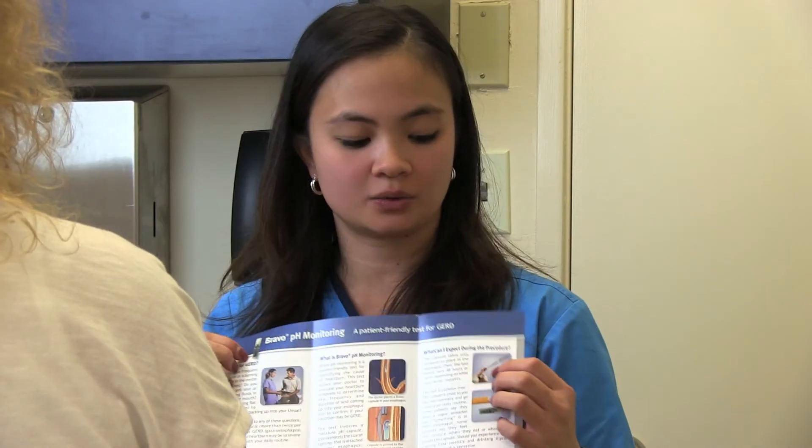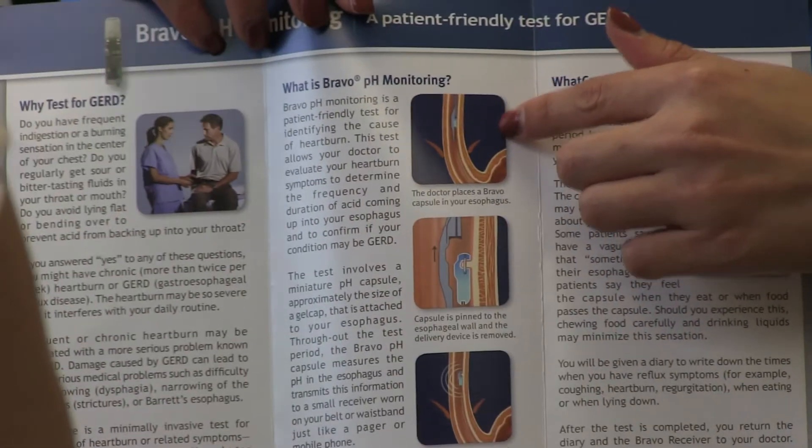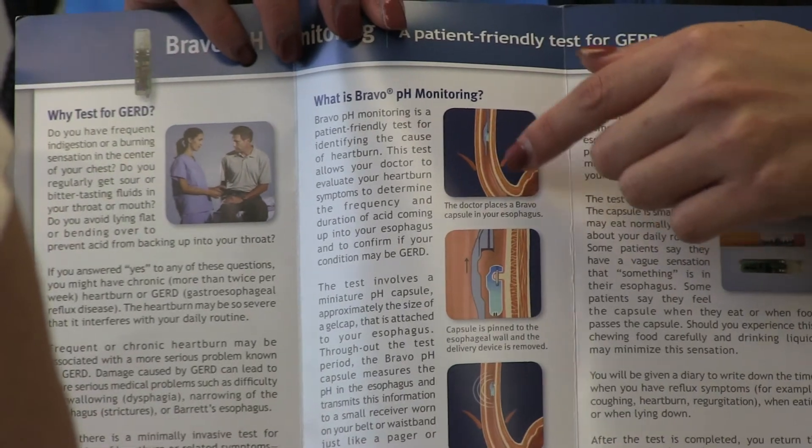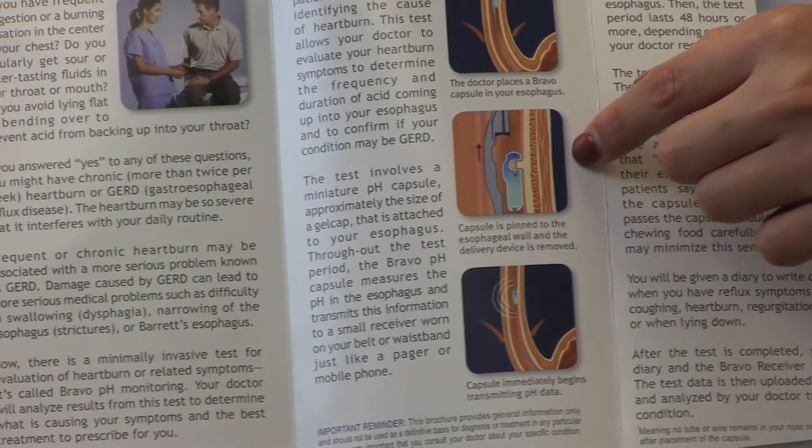Hello, how are you? Dr. Simoni wants you to have a Bravo capsule placement. The capsule is attached to a wire that will be guided down into your esophagus and will sit six centimeters above the sphincter between your esophagus and your stomach. With suction, it will grab a small piece of your esophageal mucosa. Within 30 seconds, he will release the capsule and take out the wire, so it's just the capsule sitting in your esophagus.